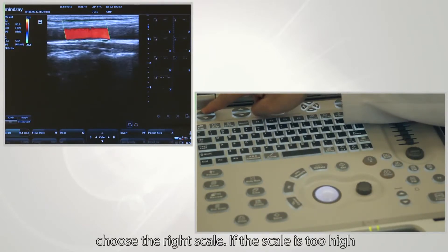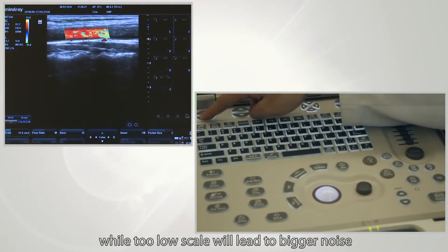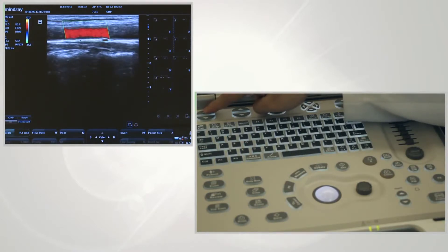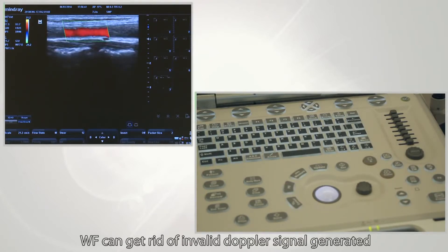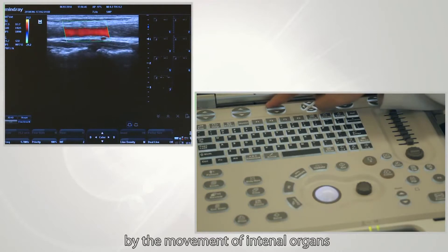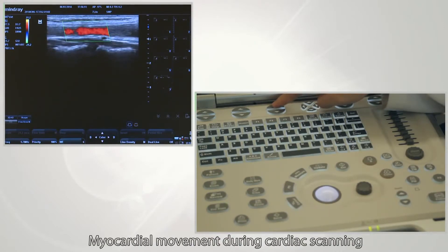Choose the right scale. If the scale is too high, blood flow will not be displayed properly. WF (wall filter) can eliminate invalid Doppler signals generated by the movement of internal organs — for example, Doppler signals generated from myocardial movement during cardiac scanning.